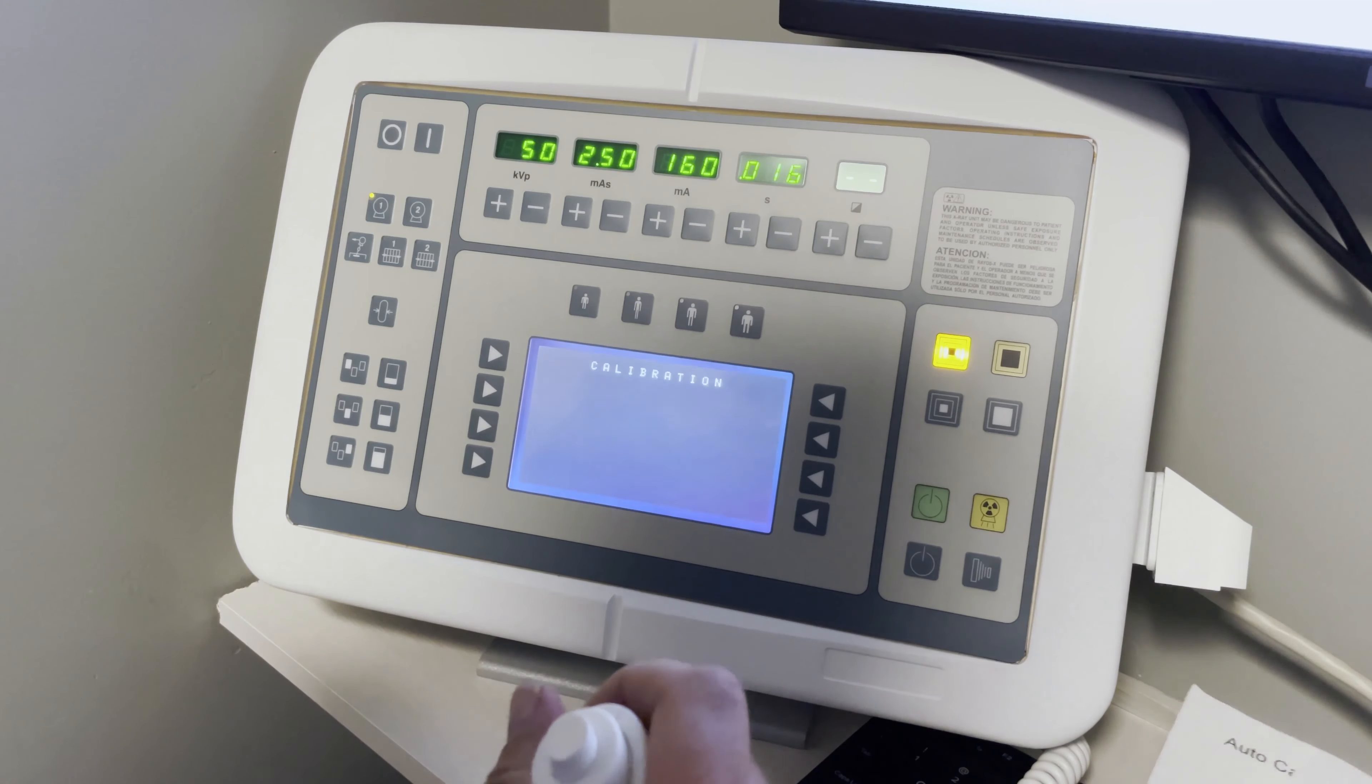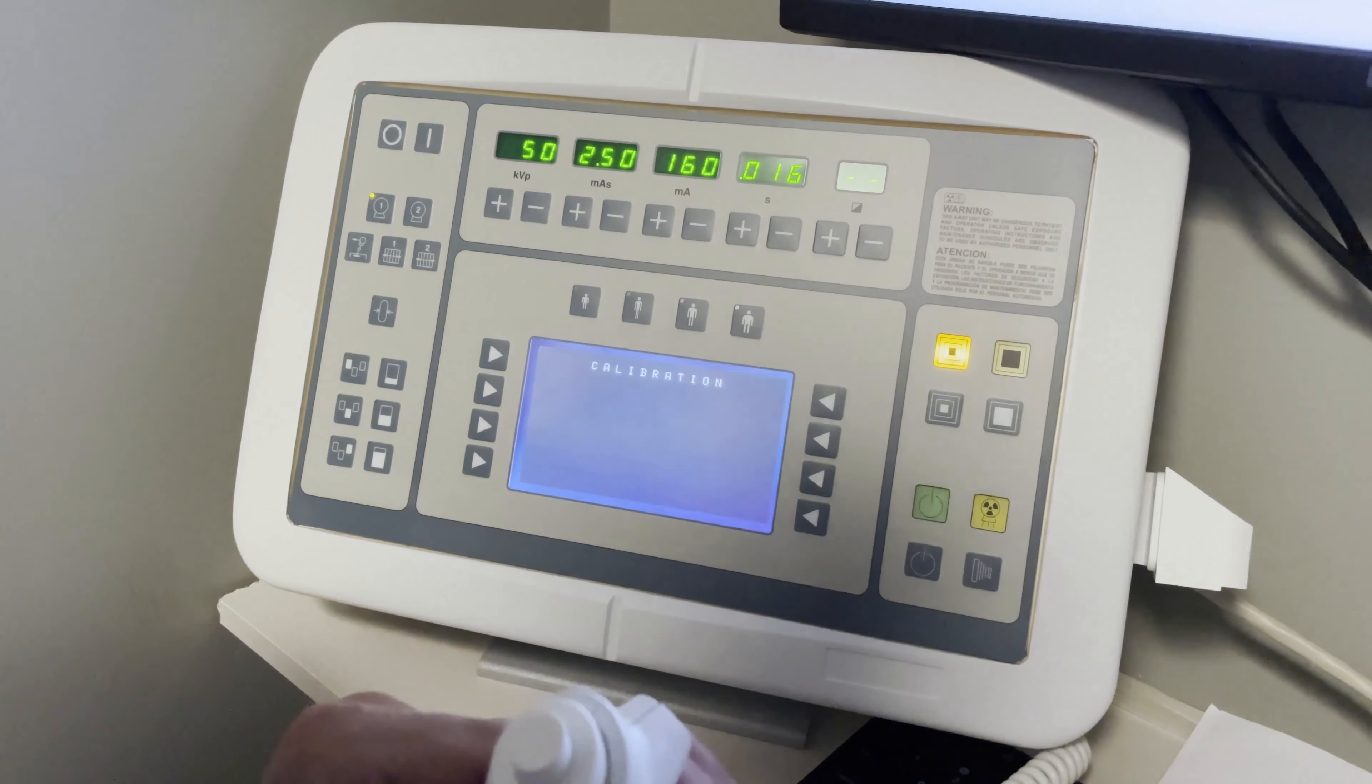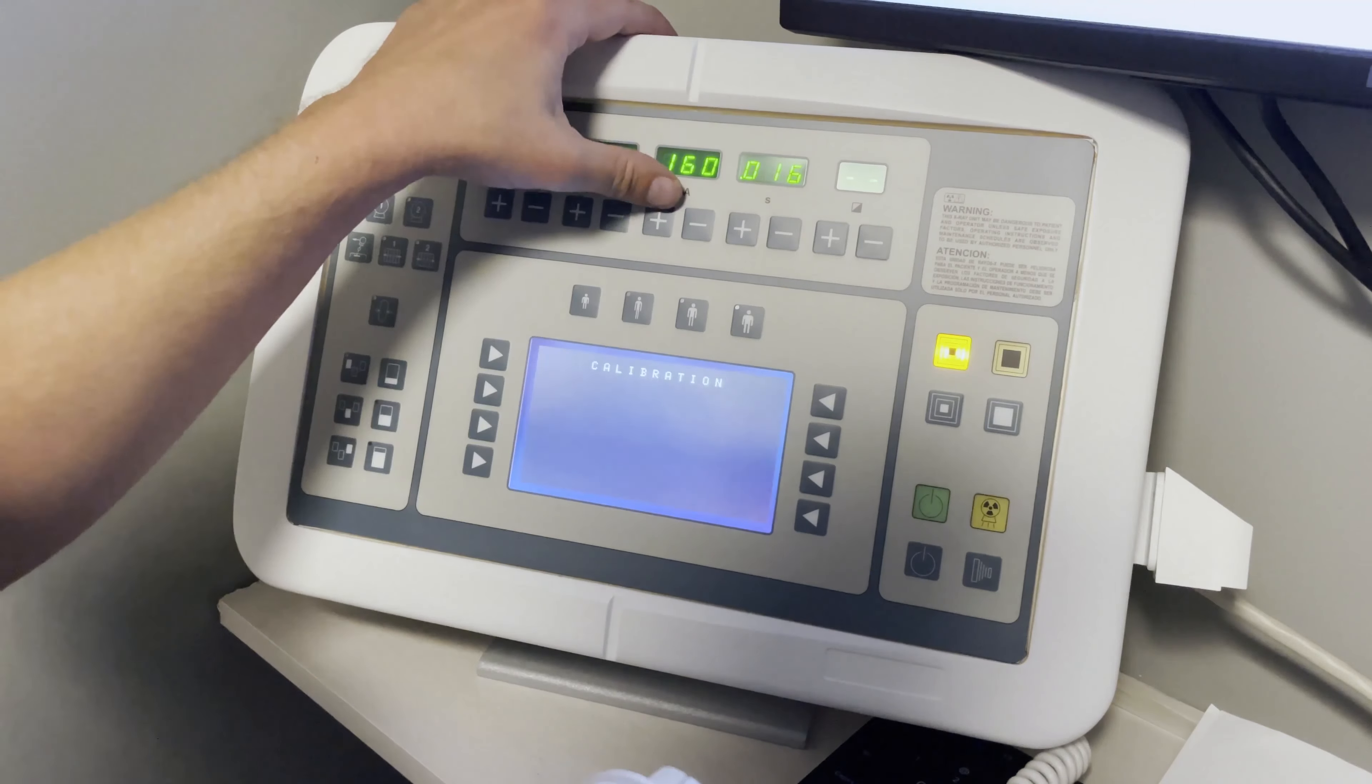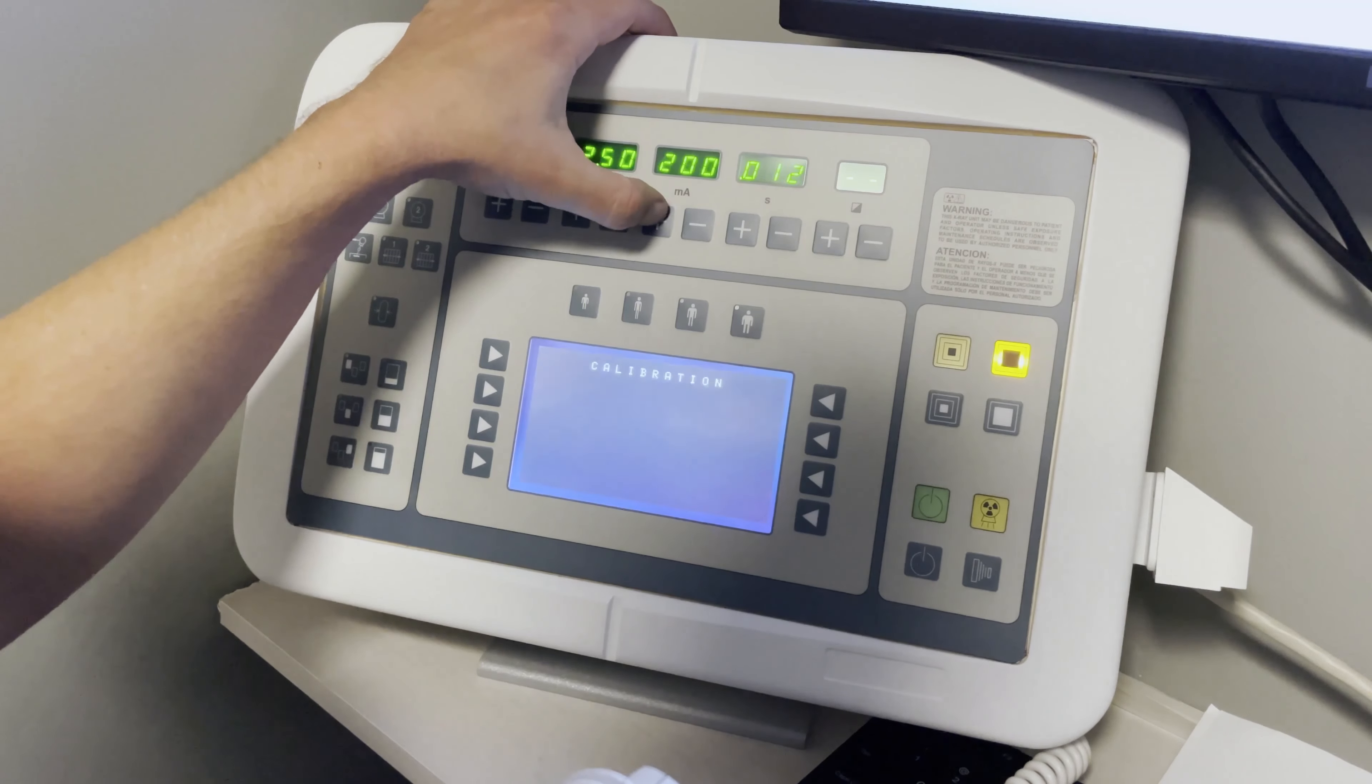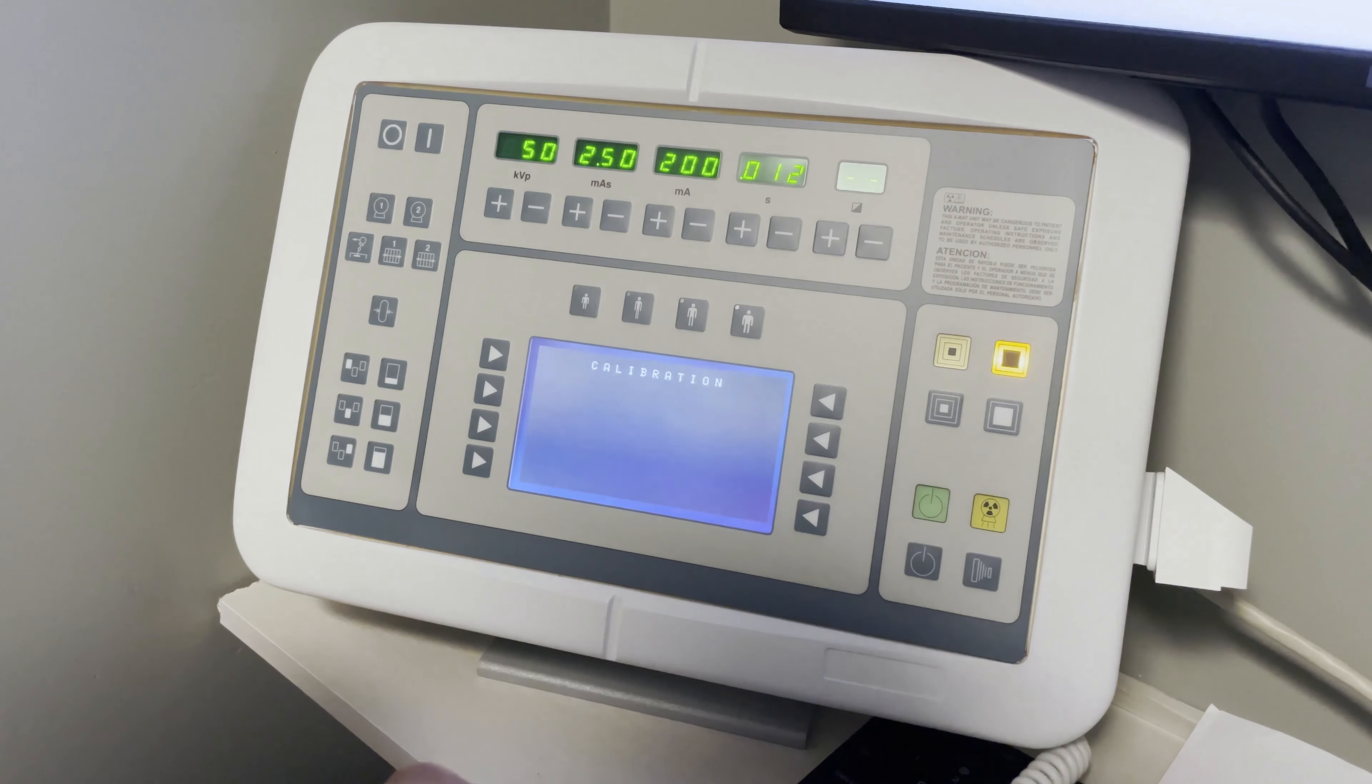Now that we've finished the low focal, we're going to move to the high focal. To move to the high focal, we want to increase the MA from 160 up to 200. And you'll see that it will move from the low focal to the high focal.